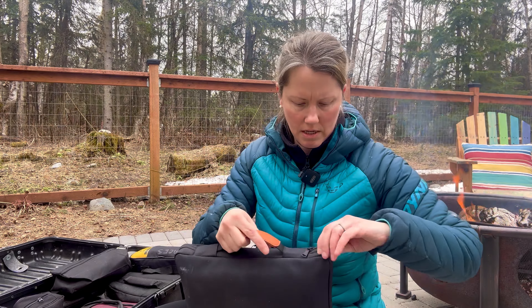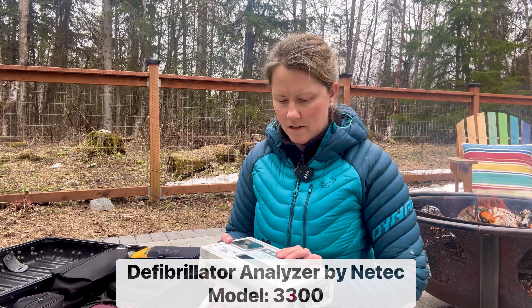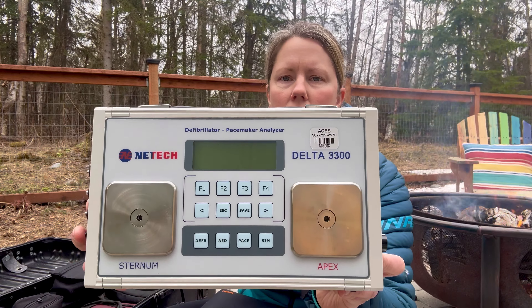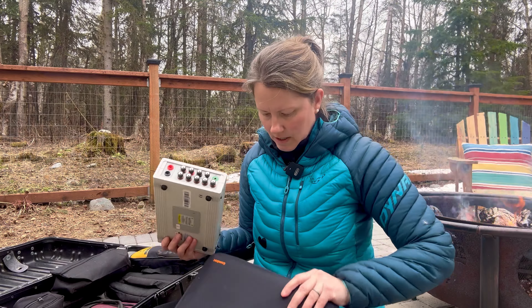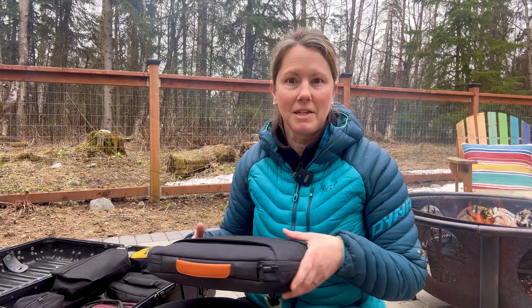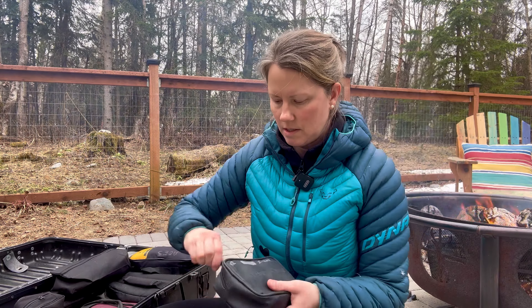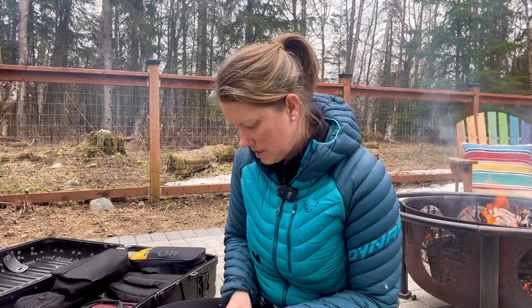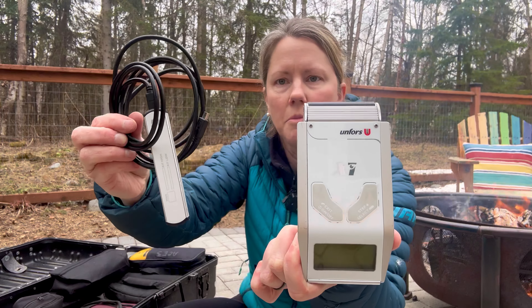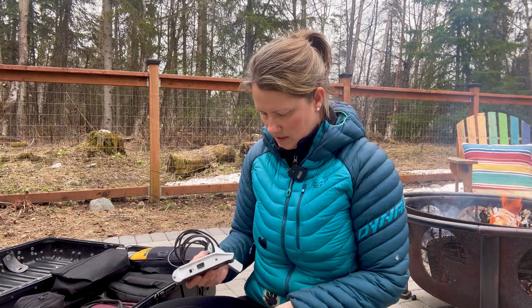This is a defibrillator analyzer, and this is a new one — I was so excited about this because it is half the size of the older model. I had to look online for a case because they didn't make a small case available with the unit; the one that came with it was really big and bulky. It took a few tries to find the right size, but I love it because it fits nicely in my pack or toolbox. I also use this for testing X-rays, and I really like that it has a cable so I don't have to constantly walk back and forth to get my readings.